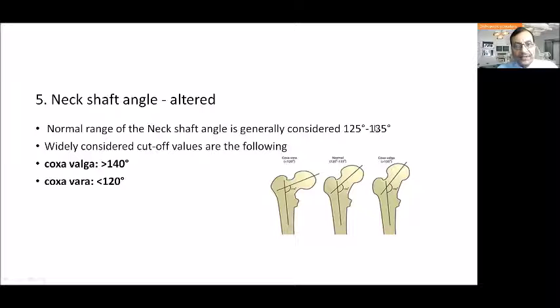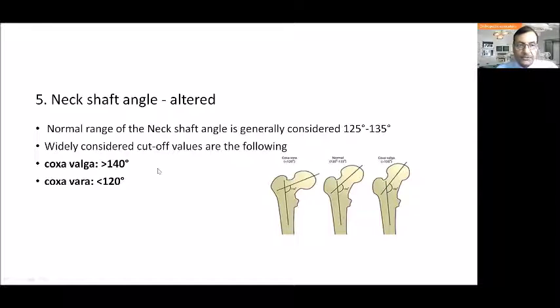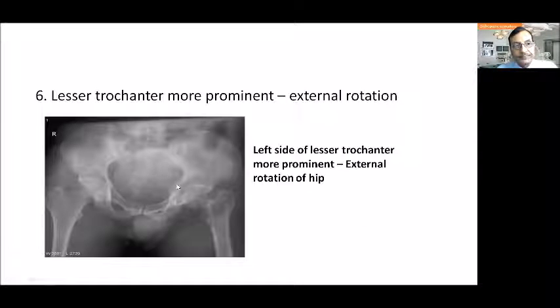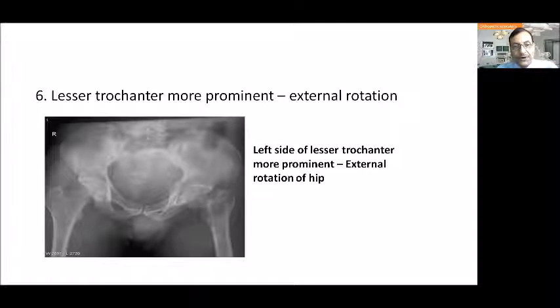The neck shaft angle: for basal-type fractures, the limb is usually in varus deformity. The normal neck shaft angle has the neck and shaft at roughly 125–135 degrees (some texts say up to 138–139 degrees). Coxa valga is more than 140 degrees; coxa vara is less than 120 degrees.